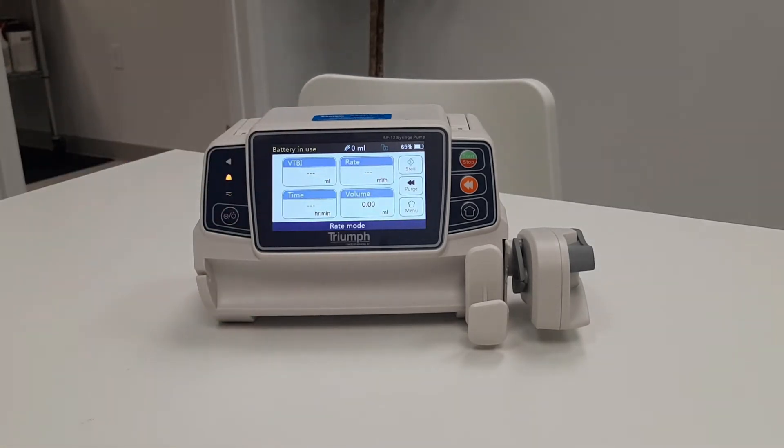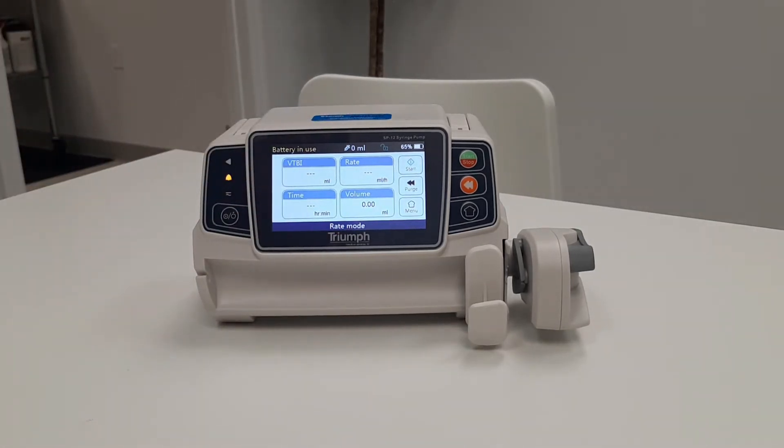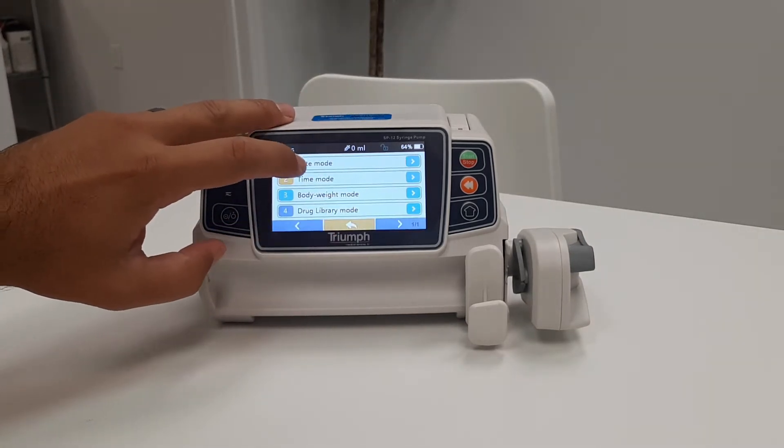The next page is the home screen where infusion parameters will be entered. The current infusion mode can be found at the bottom of the home screen. There are two different ways to change the current mode. The easiest way is to touch the bottom of the home screen and select your preferred mode.